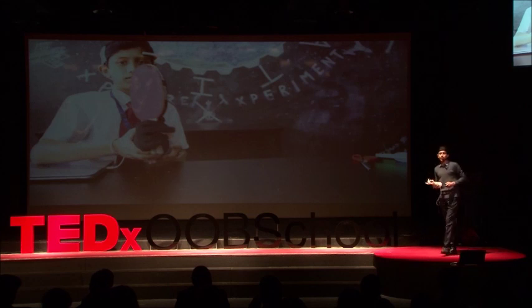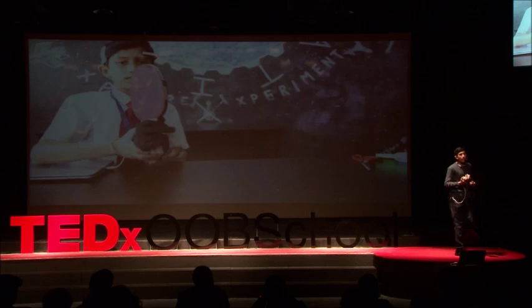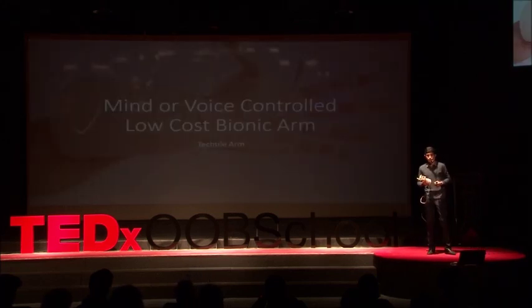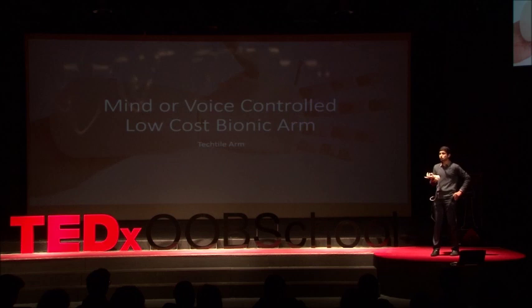While testing this prosthetic, I realized mind control was not the most convenient way for some people. And so I came up with the second version of it, which is the voice-controlled version. With this version, you just connect your phone to the hand via Bluetooth and speak certain voice commands, and the hand performs those gestures for you. Let me demonstrate that to you all.